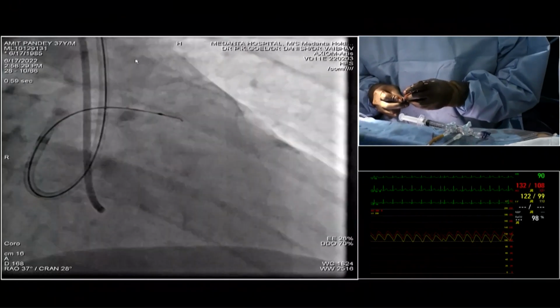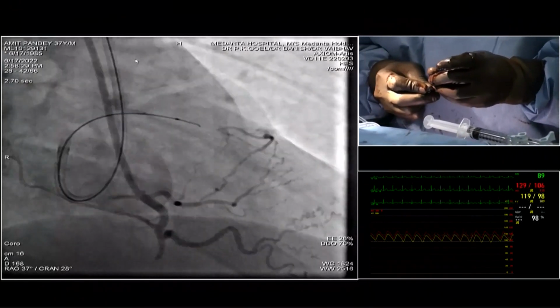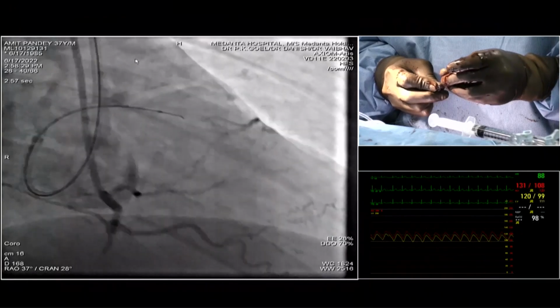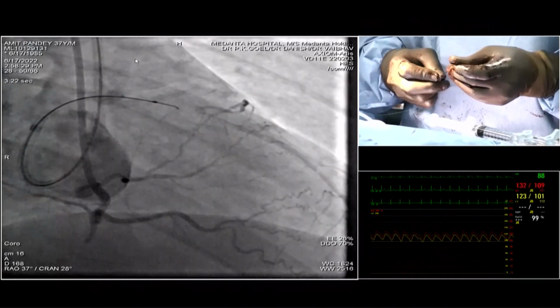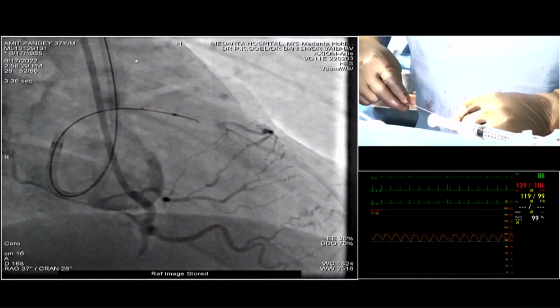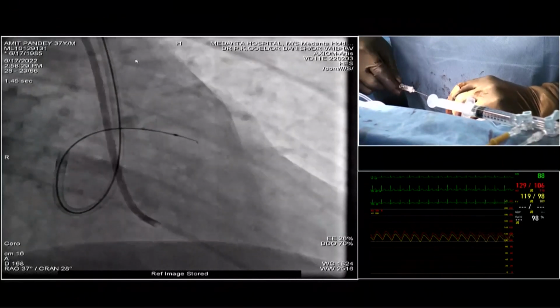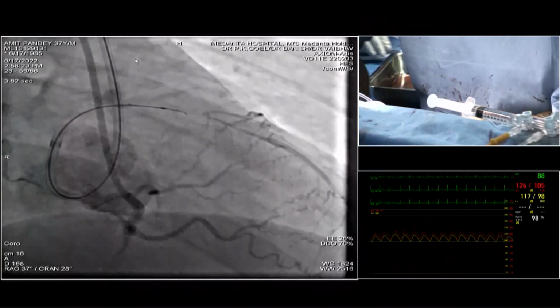Conquest. Super. When the wire is not progressing, what are the options, Dr. Arun? At this stage, it looks like a simple CTO for a very seasoned operator, but it is troubling.